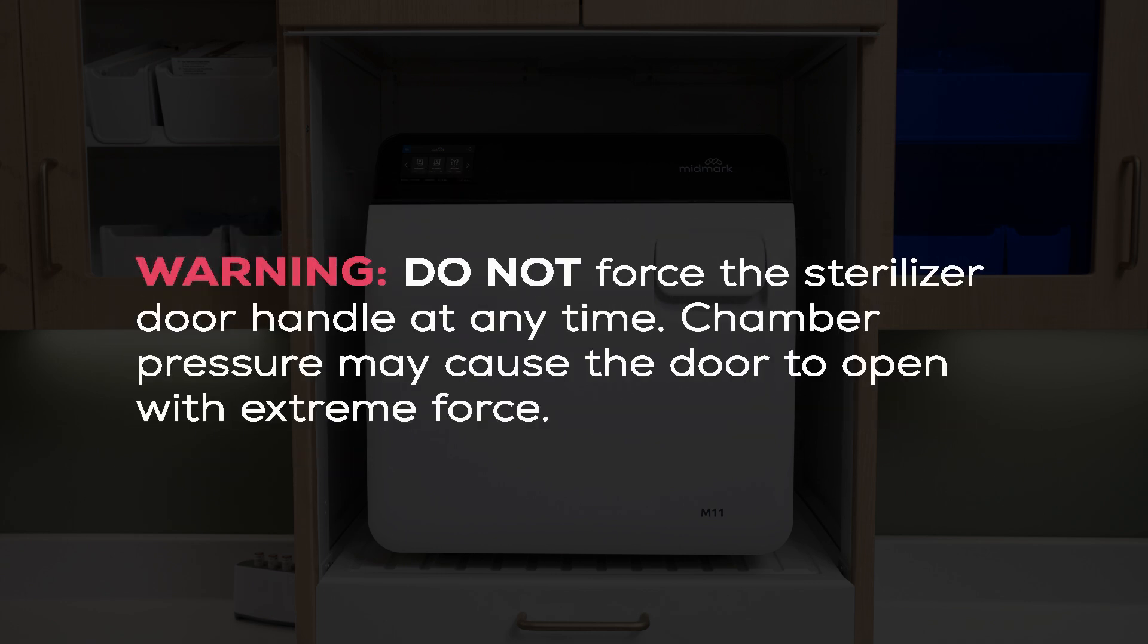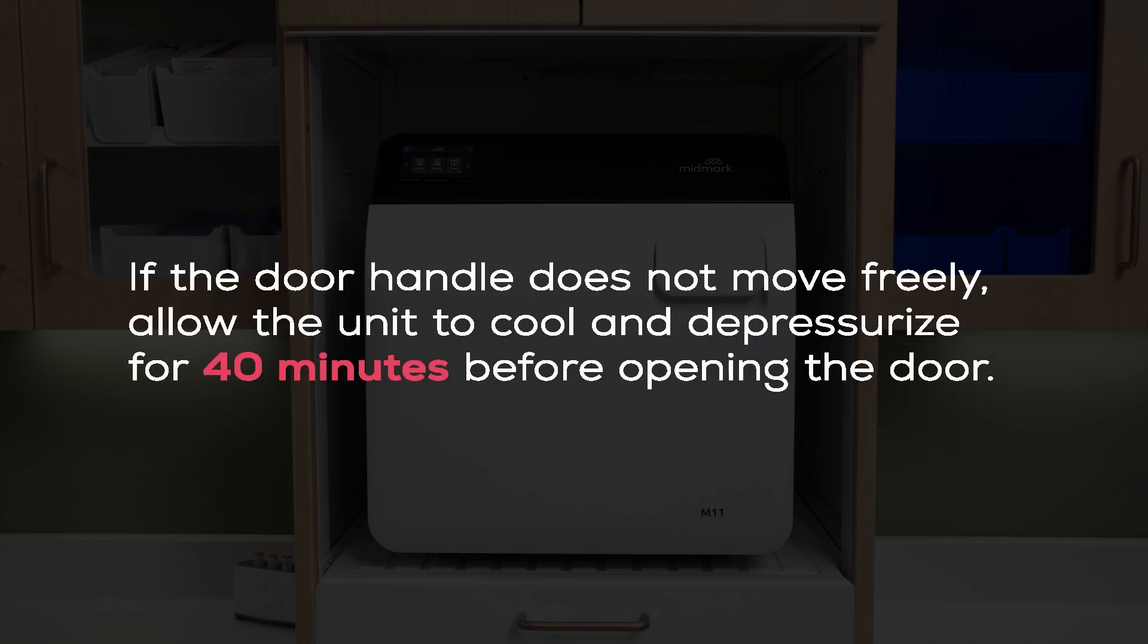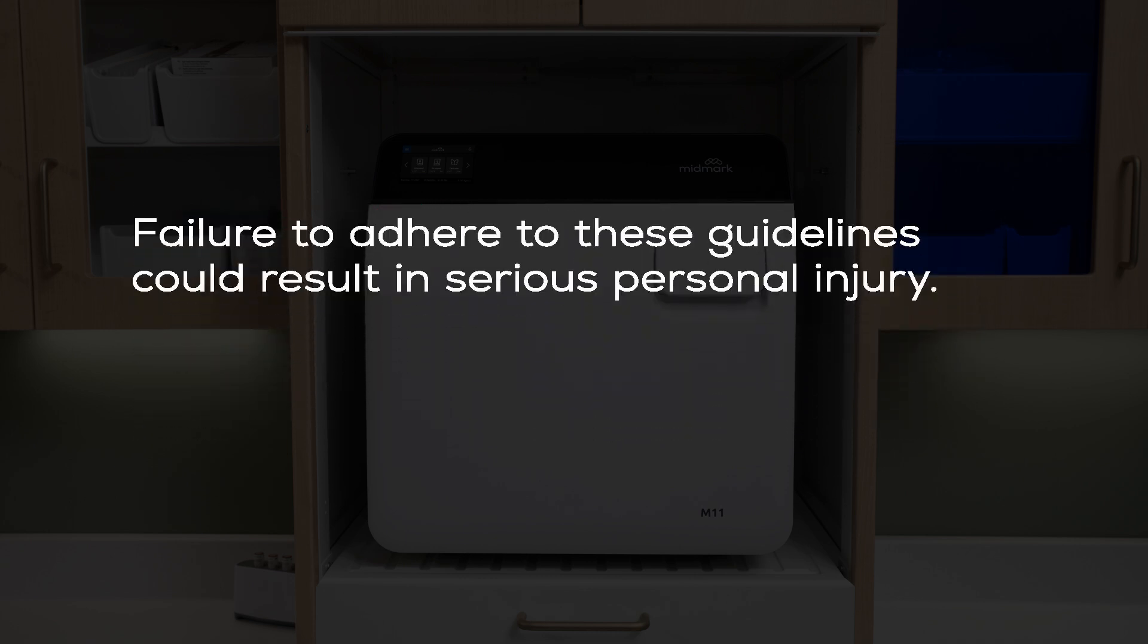Do not force the sterilizer door handle at any time. Chamber pressure may cause the door to open with extreme force. If the door handle does not move freely, allow the unit to cool and depressurize for 40 minutes before opening the door. Failure to adhere to these guidelines could result in serious personal injury.